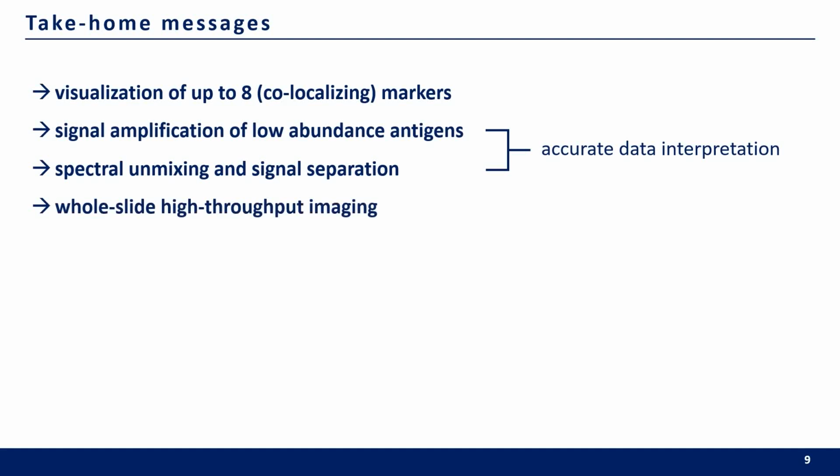Multispectral imaging of multiplex immunofluorescence is a high-throughput method that scans whole slides, offering information not only on the tissue of interest, but also on surrounding tissue, unlike other methods such as CyTOF or Codex, which use tissue microarrays, therefore only offering very limited spatial information.